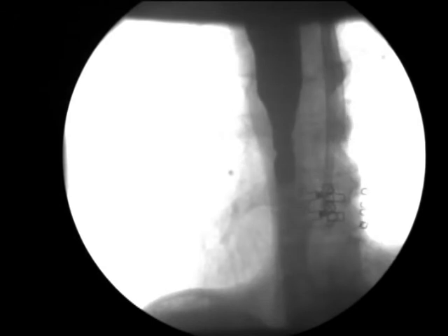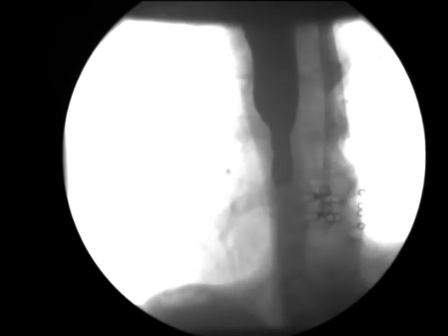You burn those tissues, and the tertiary contractions don't work, and especially at this level, it would be very hard for the patient to eat as they were going through that process. If in fact this is cancer, could just be a little shelf that's in there from the tissues, but because of the significant weight loss and the conditions surrounding this patient, that's what I would suspect. And then I would recommend that they use the PEG and do no oral feedings.